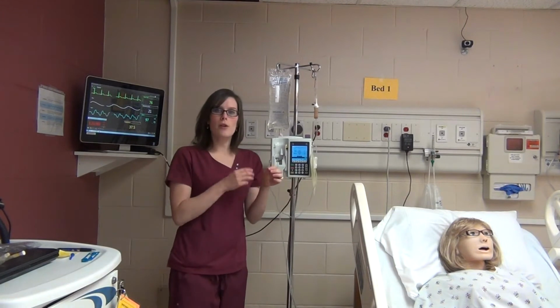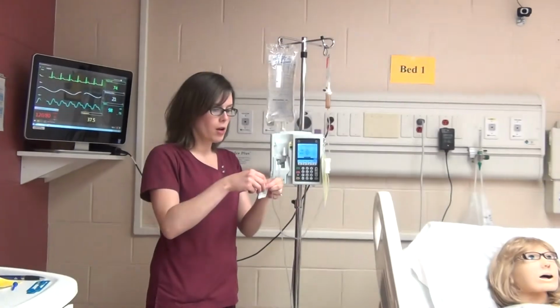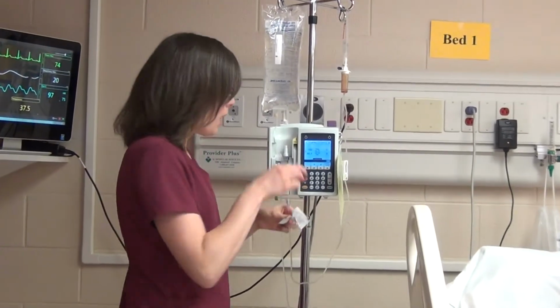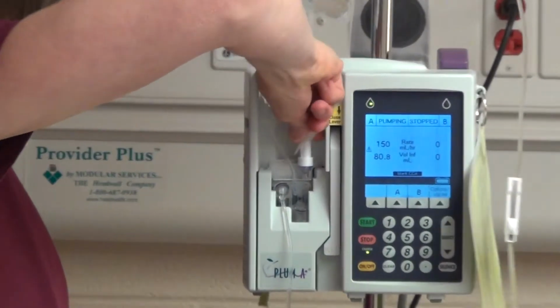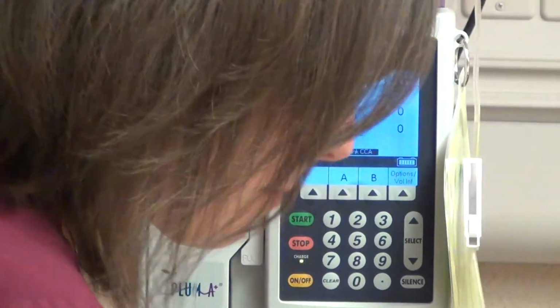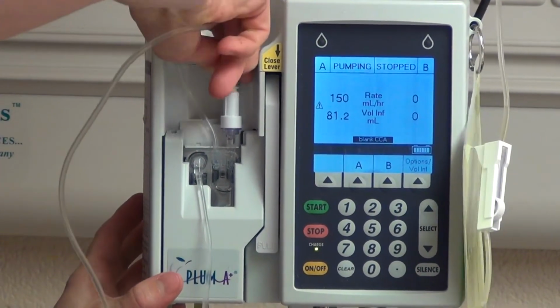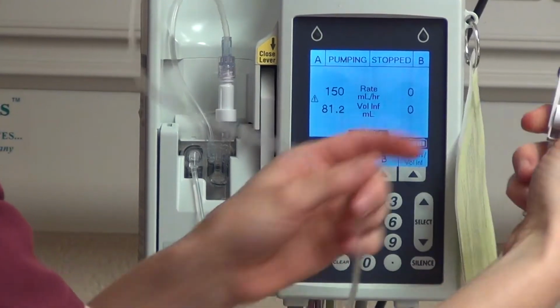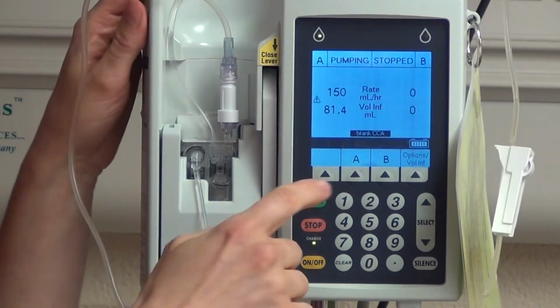And then because this is going to be an antibiotic that's set on the pump, I want to do an alcohol swab on the port right here. And then you can hook it in. Now that it's hooked in, I can go ahead and open up my roller clamp. And now we're ready to program the pump.